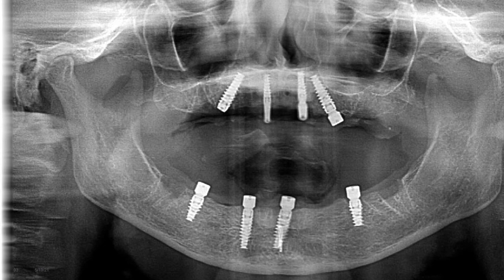When they come to our office, everything's pre-planned. This is why it takes a little time to work out. That's why it's not teeth that day when they come in, but there's planning. We're measuring before we cut. Again, any questions on the surgery, or what the needs are, or post-op questions that they might have? And again, this isn't as bad as it looks. A lot of them are getting Exparel, PRGF. They're healing super fast, super easy, and they're pretty comfortable. The biggest thing is a soft diet for about 2 months because these implants are still healing.